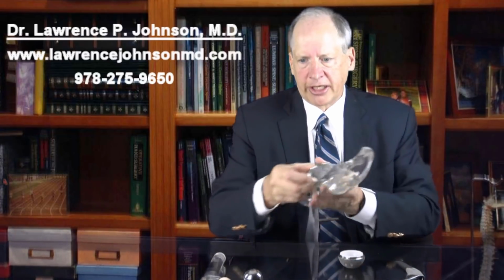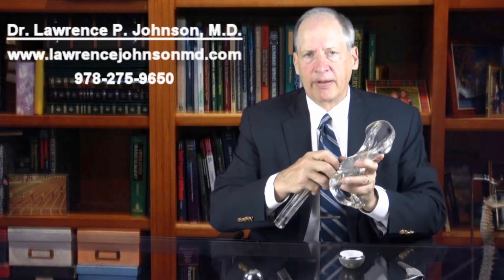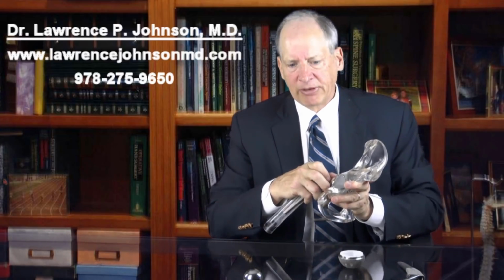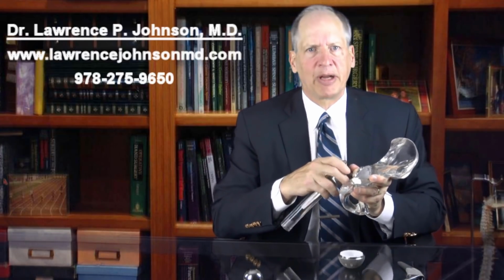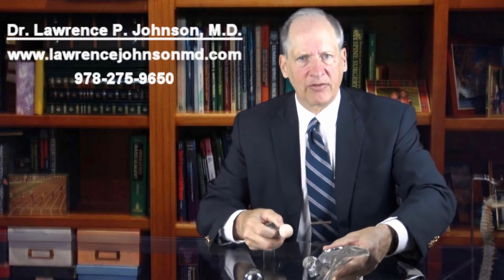Once we get this all together, we check for the stability of the hip to make sure it's not popping out or dislocating. If that's the case, sometimes we lengthen the neck a little bit. Post-operatively, we use hip precautions so the patient does not dislocate their hip. We also give antibiotics to prevent infection, as well as aspirin or other blood thinners to help prevent blood clots. The hip replacement operation is a wonderful operation for people suffering from severe hip pain due to arthritis, avascular necrosis, or post-traumatic arthritis or other conditions.